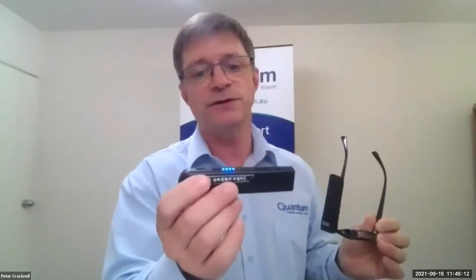And then the version called the OrCam Read, which is a small handheld version that is about the size of a highlighter pen, similar in size to the C pen, actually.